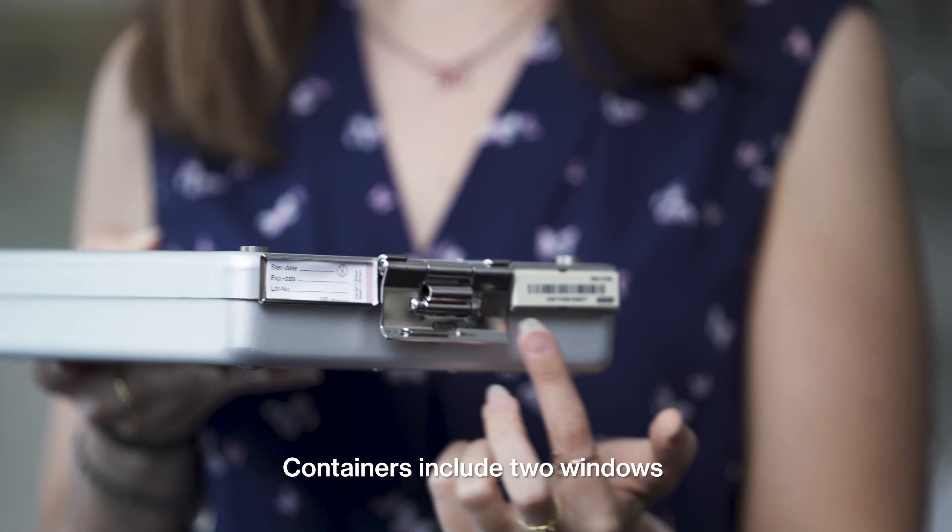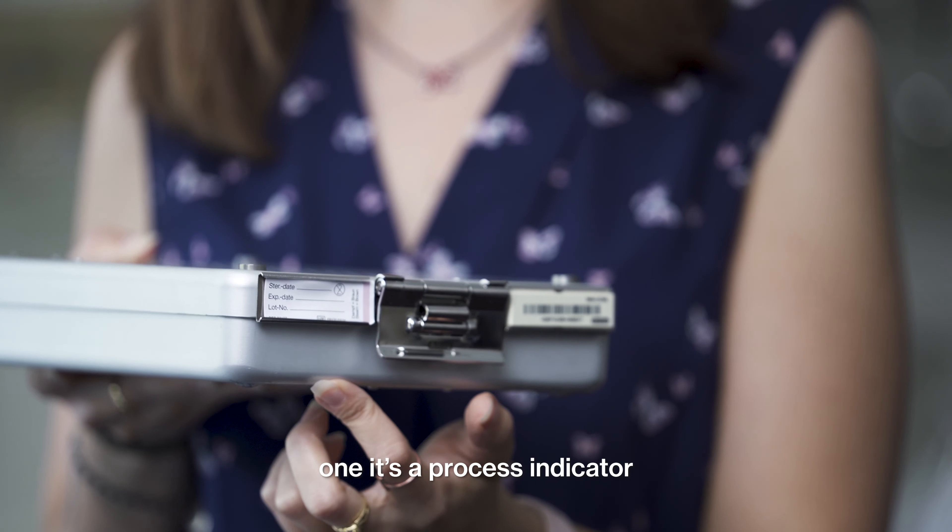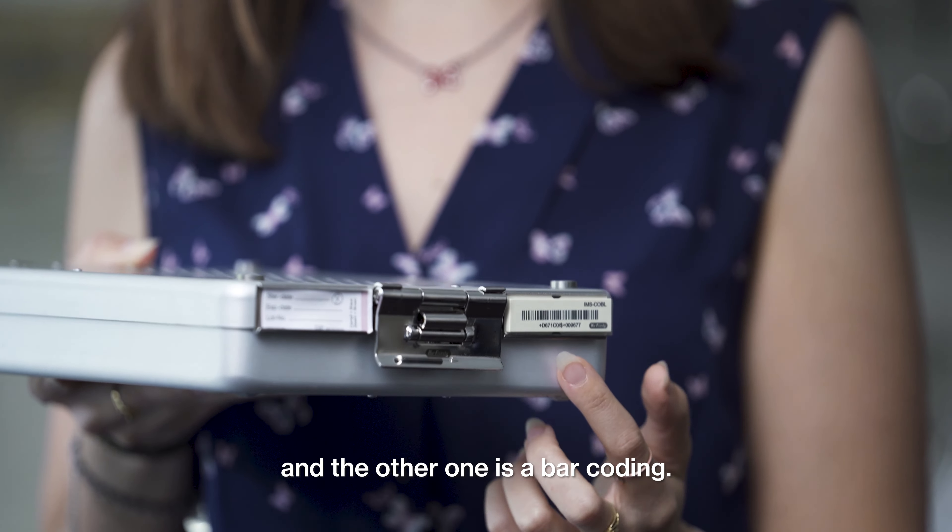Containers include two windows: one is a process indicator and the other one is a barcoding.